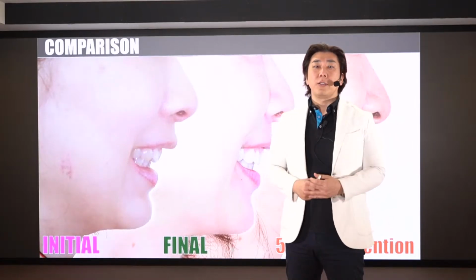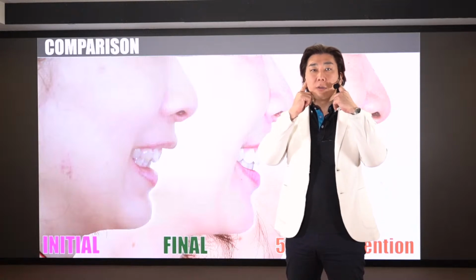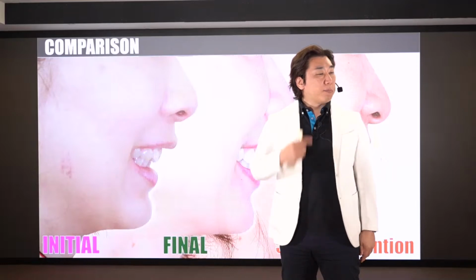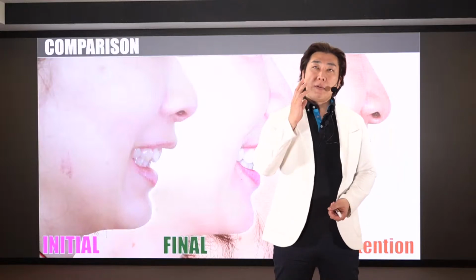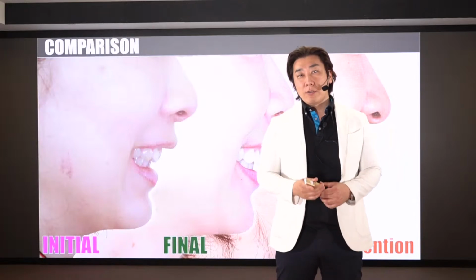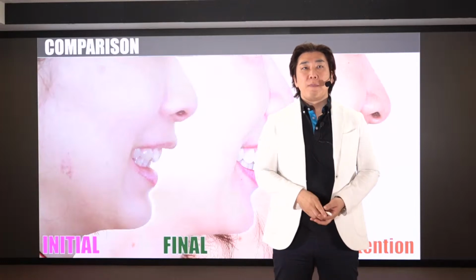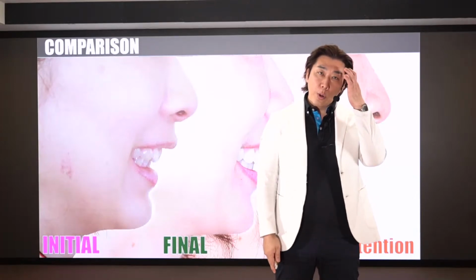So one solution is to check your patient's condyle position and check the function, the movement, take movies. Sometimes the patient's habitual occlusion is just a little bit back, then there is a problem. Sometimes the patient doesn't realize. At this time, my recommendation is please use an Aqualizer. The Aqualizer is used by the patient for just 1 week or 5 days. This is in plastic. The patient wears it in the mouth about 12 to 15 hours per day.